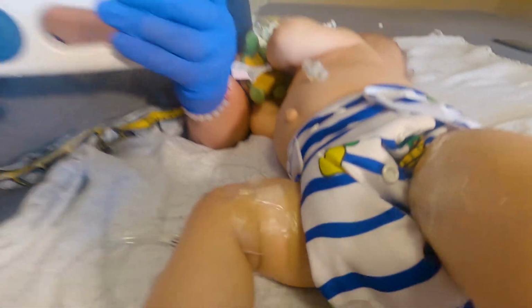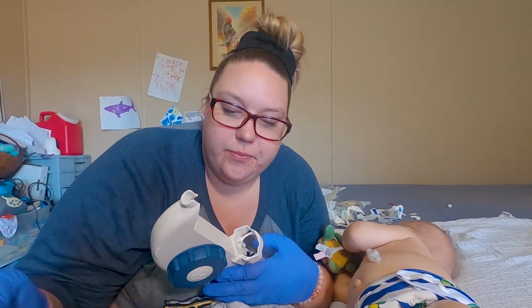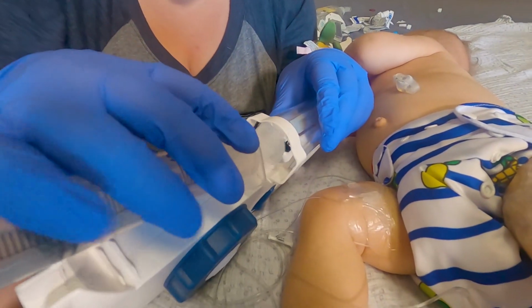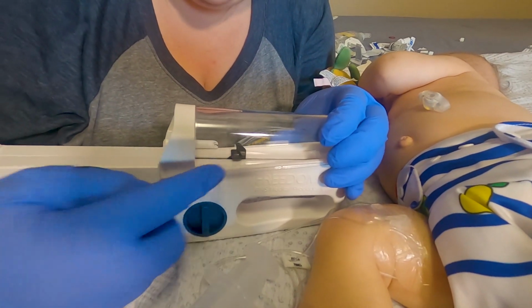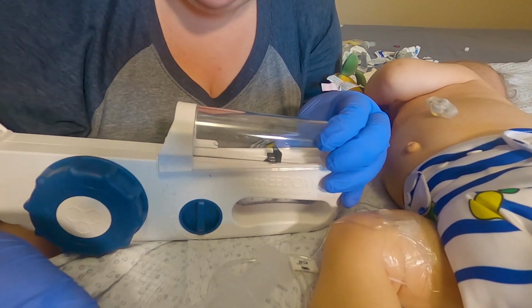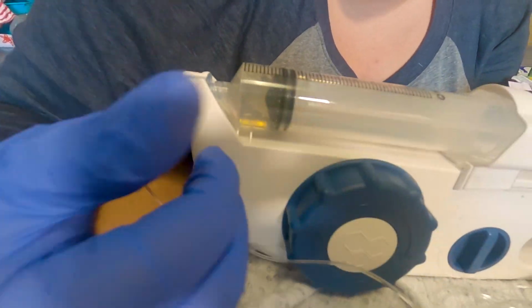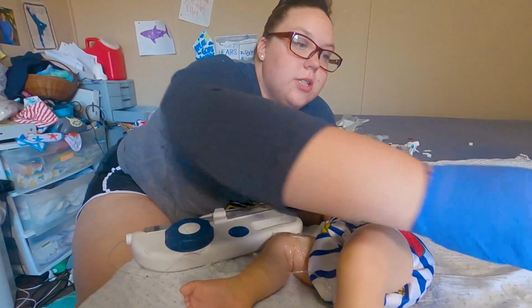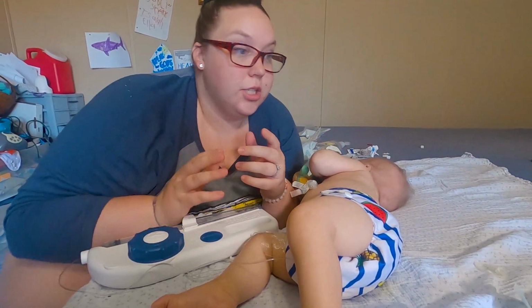So this is our Freedom Infusion pump. It looks like a bad 70s toy, but you take your syringe, not your needle. You take your syringe and hold on. First, you see here, it's like cranking it back. So you take this and put it in here to where the circle part hits here. And then all you do is flip it on. It is locked in place and it starts the infusion. His infusions usually take around an hour to an hour and a half, depending on how many times I have to pause it or readjust.